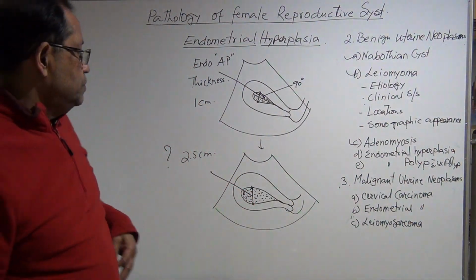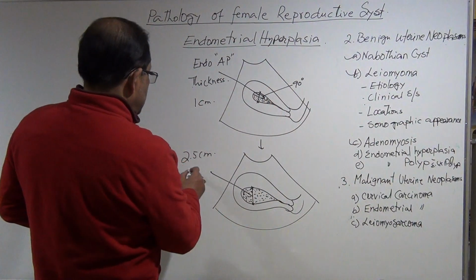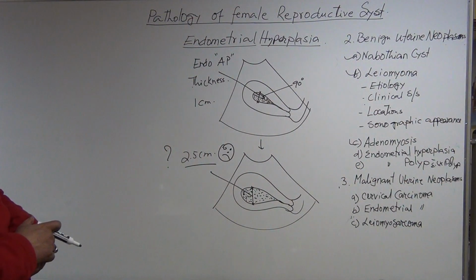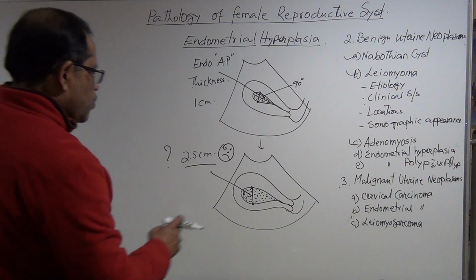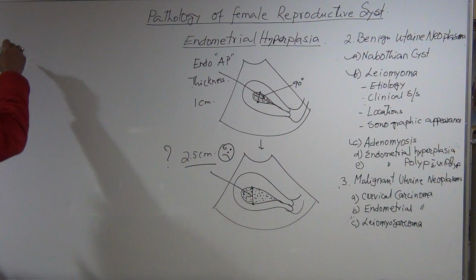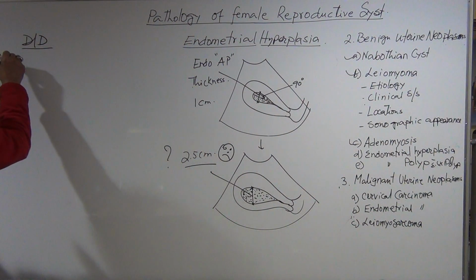Okay, so now let me go into a little more detail. You found this situation. Then you need to understand what it could be. Is it simply endometrial hyperplasia, or what is the differential diagnosis of enlargement of the endometrium?